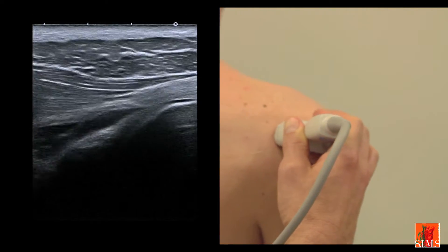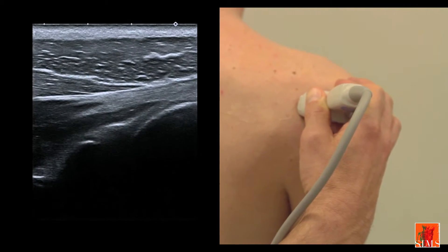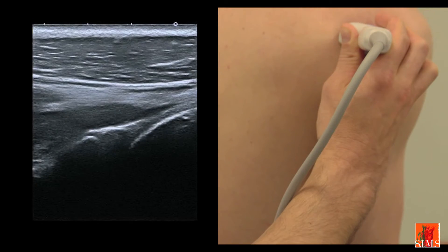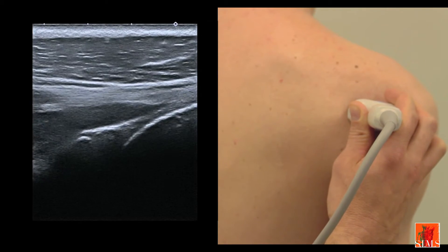In depth, we note the existence of that joint and of a hyperechogenic triangular labrum which we can see here. When this horizontal view of the posterior glenohumeral joint is performed in neutral rotation or in medial rotation, the infraspinatus tendon is flattened against the joint.